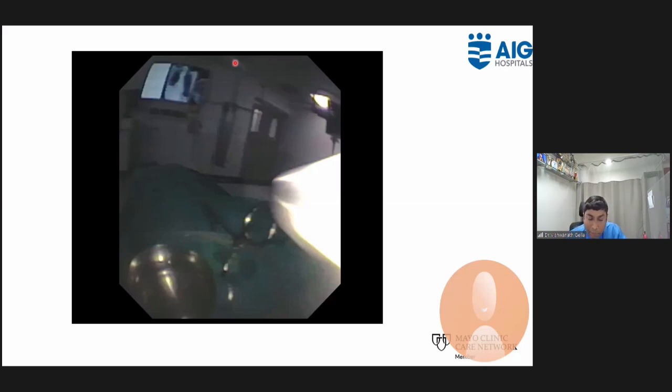Here, what is happening is the Joule-Thomson effect. When you are applying the tip of the cryoprobe to the pleura and activating it, the tip gets cooled intensely to a temperature of minus 60 to minus 80 degrees centigrade, and the tissues which are in touch with the cryoprobe tip get frozen.